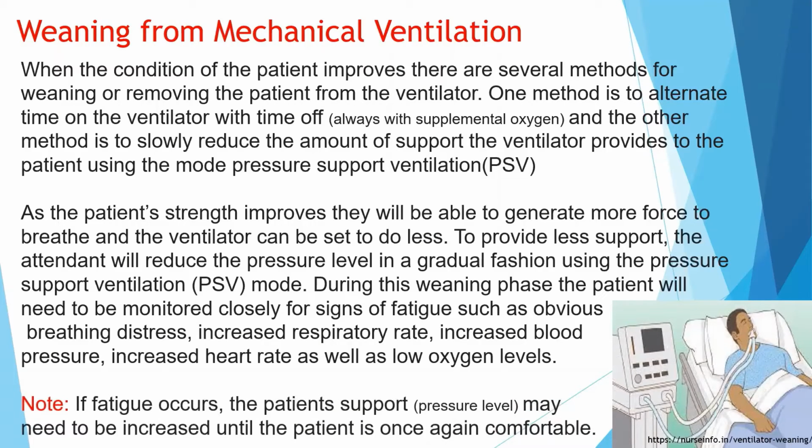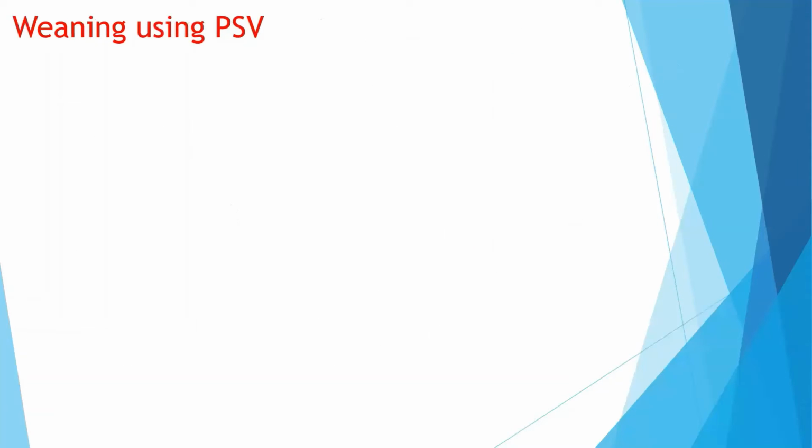Note, if fatigue occurs, the patient's pressure support level may need to be increased until the patient is once again comfortable, or the mode may need to be changed back to assist control. Weaning using pressure support ventilation.